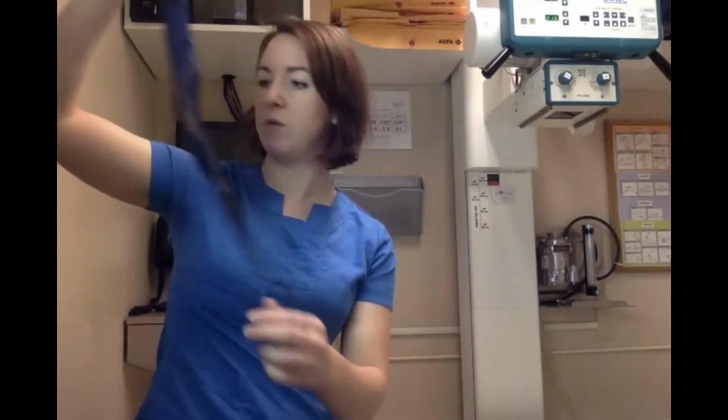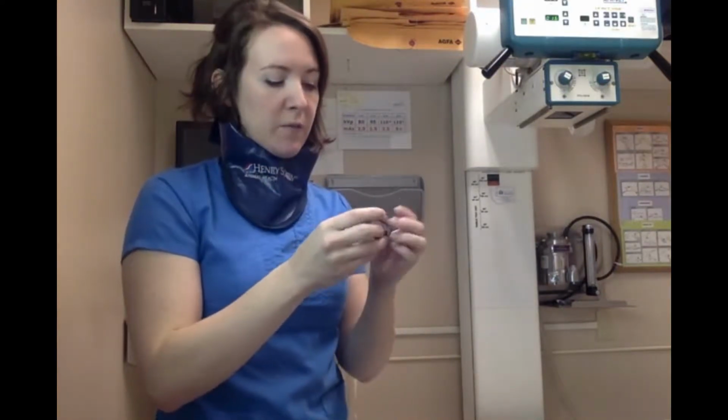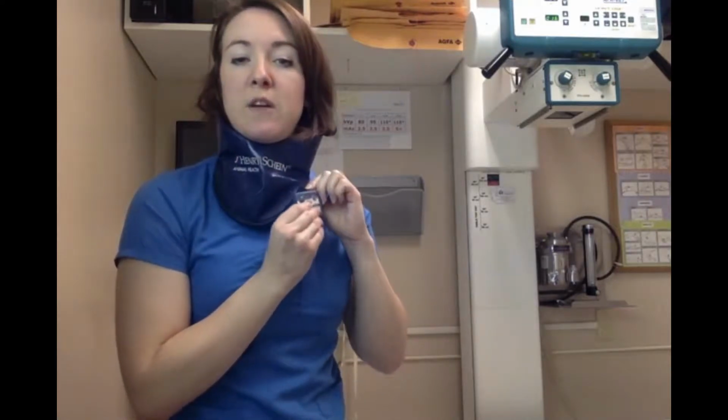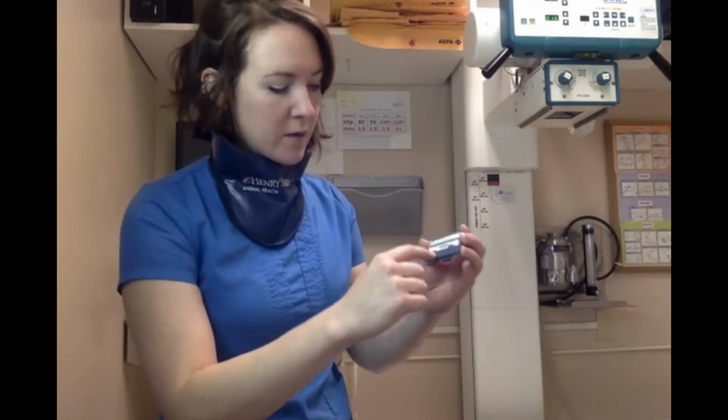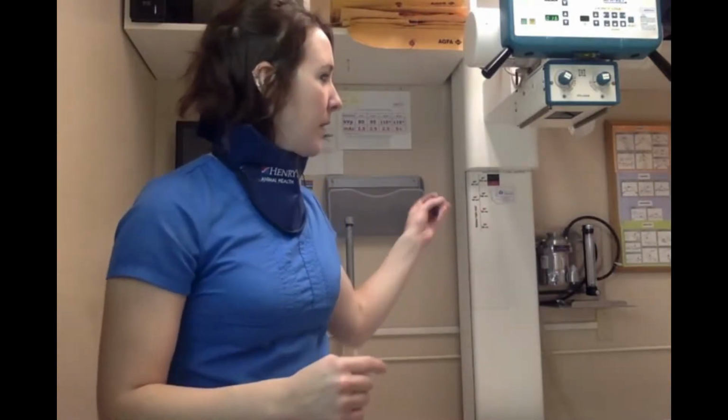One of our pieces of personal protective equipment is our thyroid shield. So I would be wearing this along with all of my other equipment, and I want to make sure it's tight enough around my neck that it covers up my thyroid gland, which would be right in the middle area of my throat here. And then I want my dosimeter badge to be clipped onto here as close to my thyroid as possible, kind of at the center of mass. And so this just takes readings as it comes in. It takes readings through this little window of any millirems that come through.